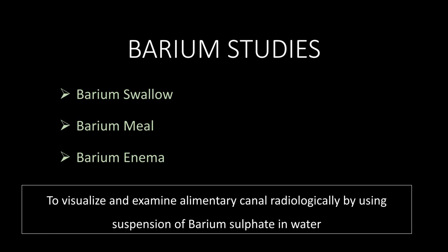Department of Anatomy, Government Medical College, Rajkot welcomes you in the lecture series of X-ray abdomen. Today we are going to discuss about a special technique known as barium studies under headings of barium swallow, barium meal, and barium enema. Barium studies are generally performed to visualize and examine alimentary tract by using the suspension of barium sulfate in water.